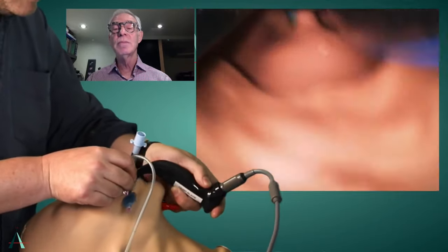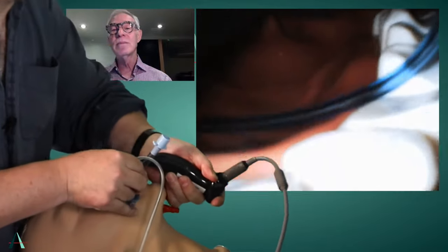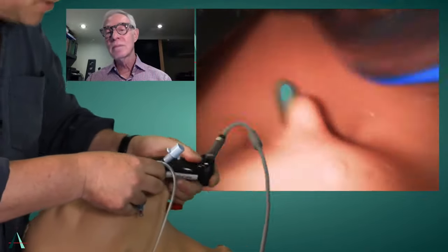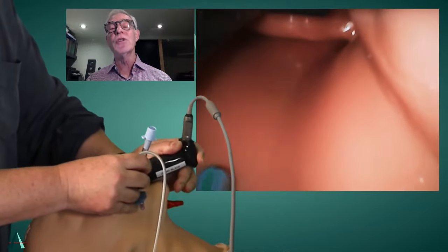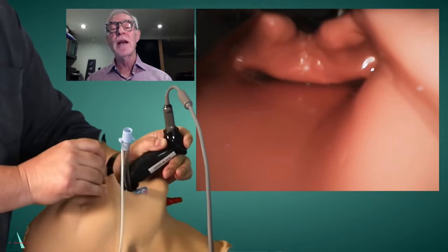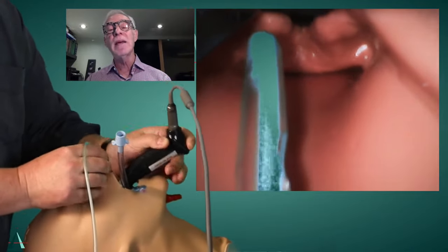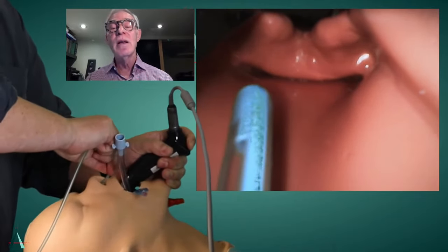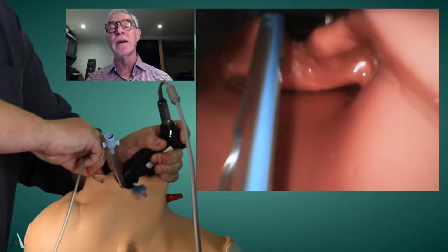Okay, so I'm going to lift the tube up. Exactly. Oops, hang on, I'm not doing this very well. Now it'll be pretty much a deeper insertion than we had before, revealing the esophagus. Now you'll advance the nasogastric tube, and you can manipulate it. So often we end up seeing that the reason we're having difficulty is the nasogastric tube is trying to go into the larynx.